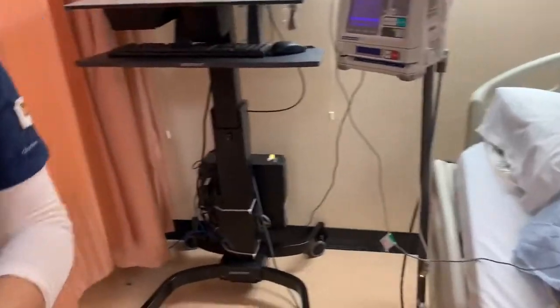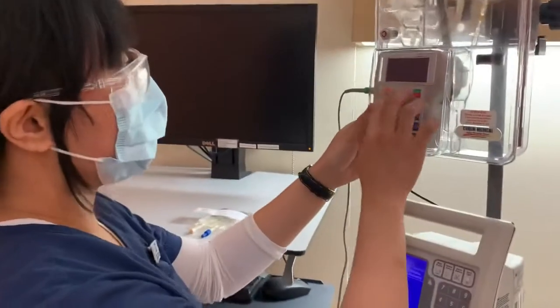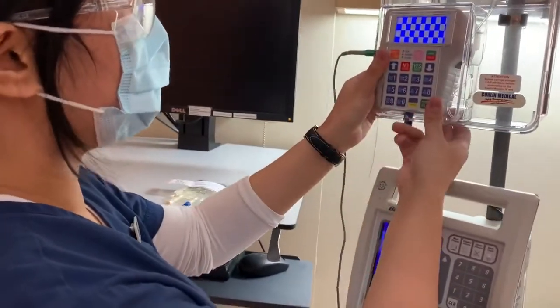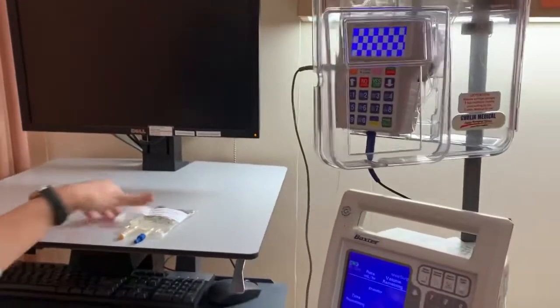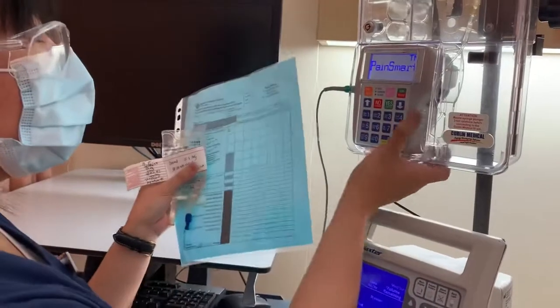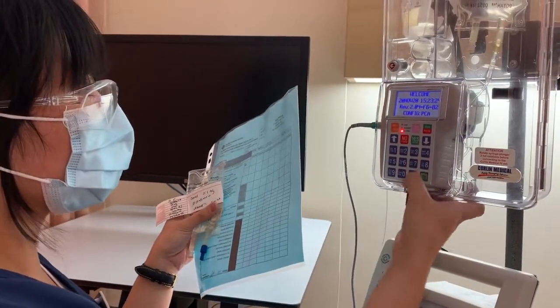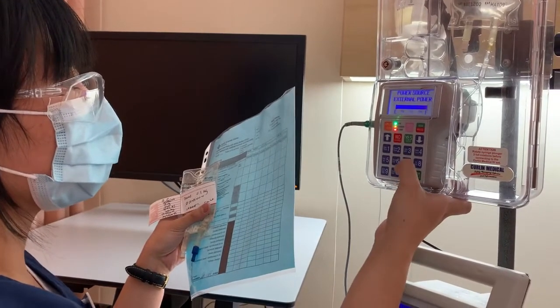So I'm just gonna wash my hands again. Okay, so now before I change the tube, I'm just gonna program the pump, and we will be comparing that with our MAR and our med label. Time? Yeah. Time? 8 minutes and a half. 8 minutes? Okay. Okay, we're just gonna wait for this one.